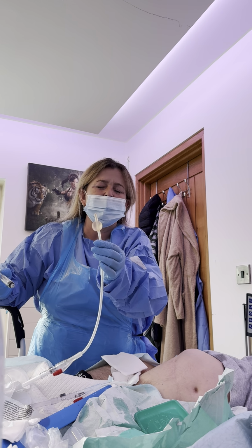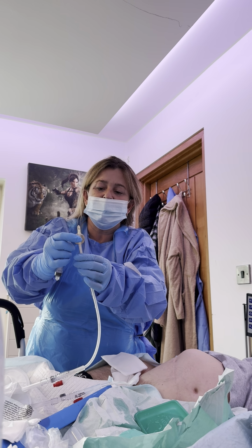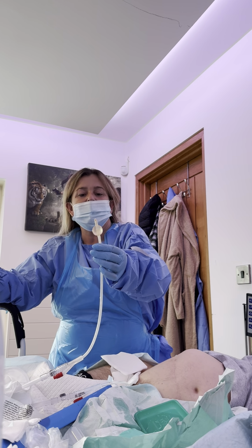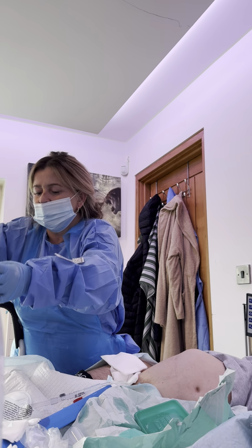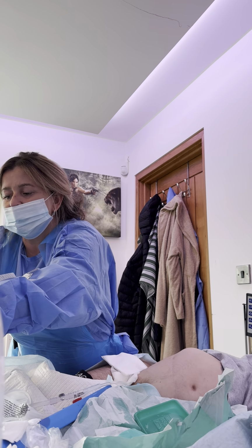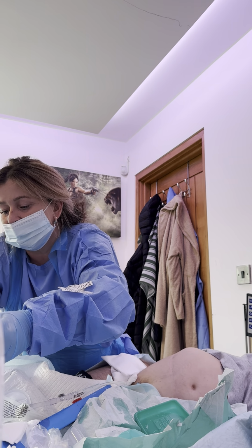But I absolutely adore it, like looking at them and having a feel. So it feels fine, and there's nothing on my glove, but that brown is not right. Definitely not right. Definitely infected. So what I'm going to do is pop that in that bag there, just to make sure that my hands, I'll take some pictures, but I'll still put it in the bag.